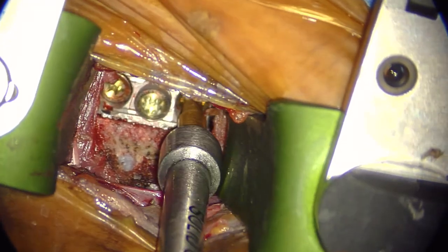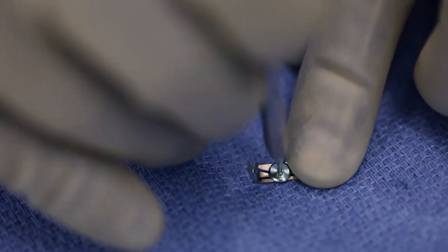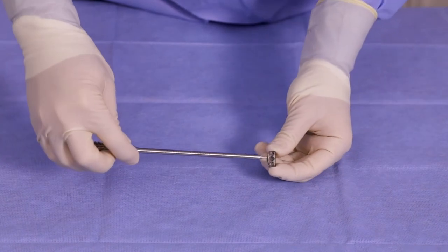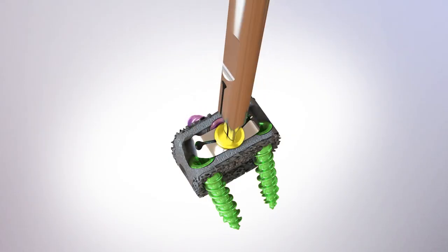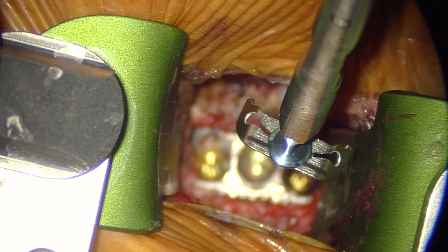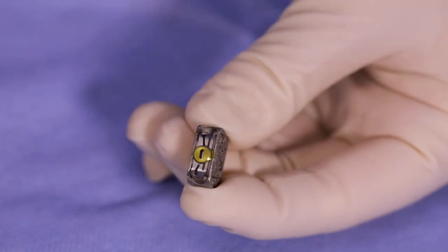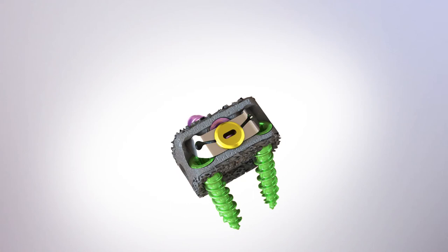Once all three screws have been inserted, you are now ready to lock your device. To insert the cover plate, locate the cover plate driver and insert the distal end into the open slot on the locking cover plate. Tilt the cover plate and push the two tabs up into the small holes above the outboard screws. Once the tabs are docked in their respective holes, push forward on the inserter to ensure that the plate is flush with the face of the cage. Rotate the center post of the cover plate by gently turning the cover plate driver clockwise 90 degrees. A tactile click should be felt when the cover plate has been rotated 90 degrees. This rotation completes the locking step and the driver can be removed with a slight backward pull. Confirm locking by visualizing that the slot across the center post of the cover plate is horizontal.